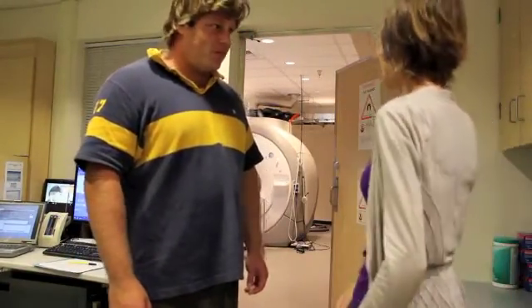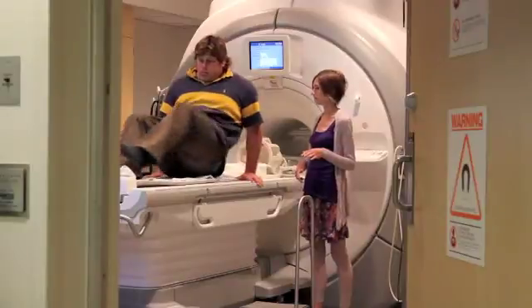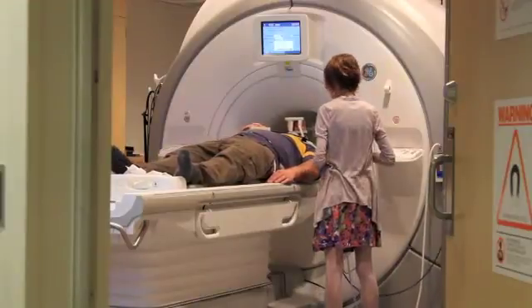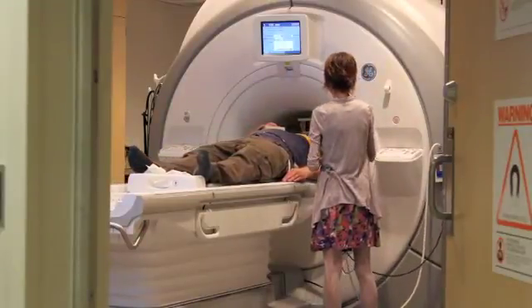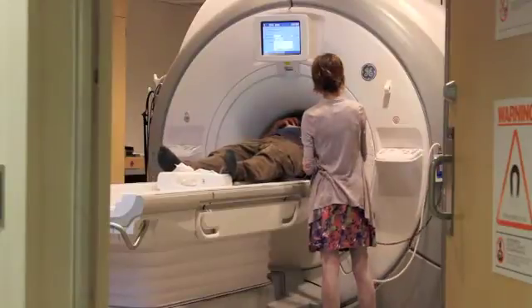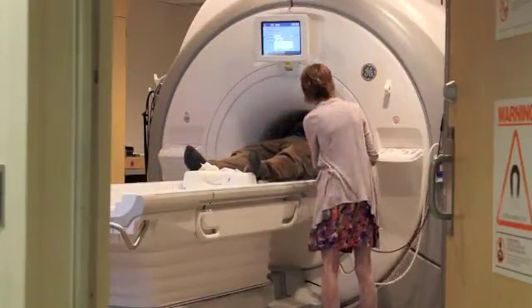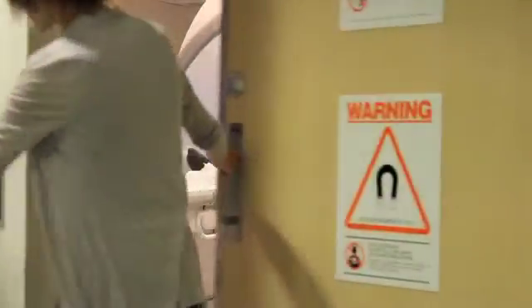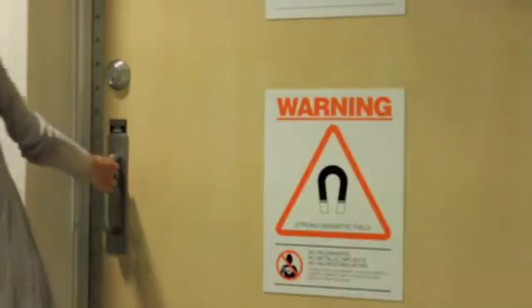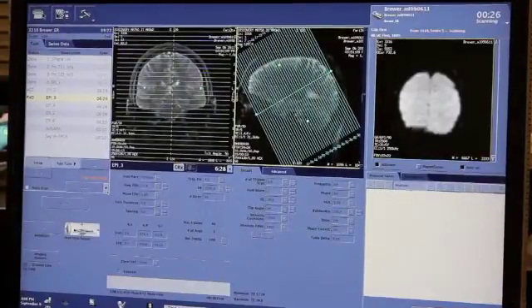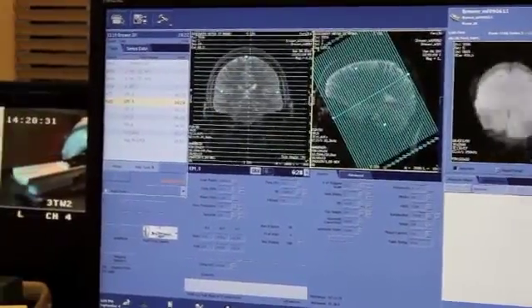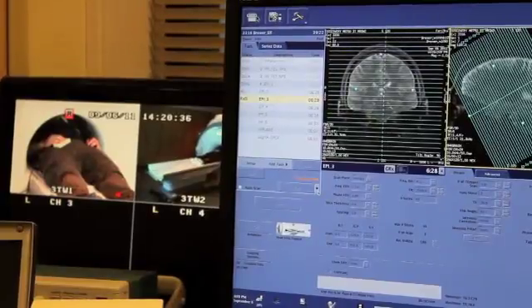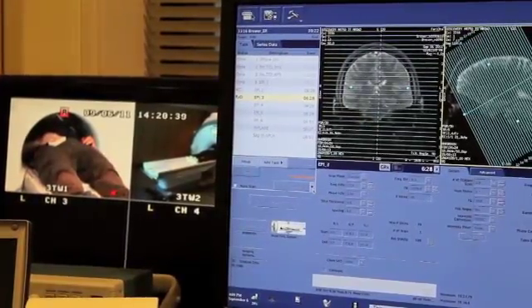All right, we're all ready to get started. Now it's time for the experiment to start. Emily has Matt lay down in the scanner, and after making sure that he's comfortable, she sends him back so they can start taking pictures of his brain and he'll start doing her memory task. Emily checks on Matt one more time and then leaves the room so that she can control the scanner from the operator room. Once the scanner starts, Emily sees pictures of Matt's brain as the scanner is acquiring them. She can also watch Matt on a camera to make sure he's doing okay, and she can make sure that her task is running appropriately.